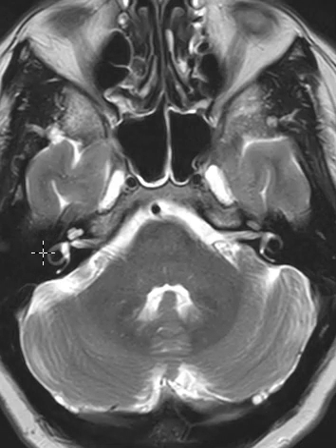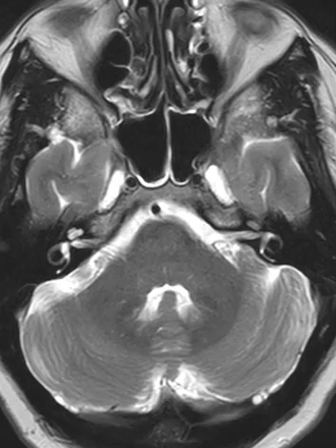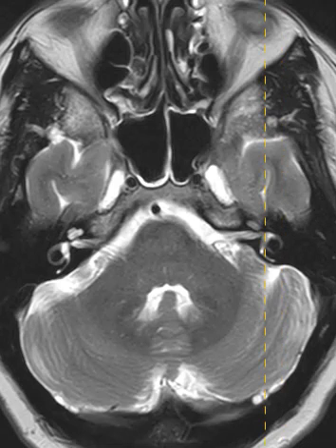Now we're going to look at the semicircular canals on what we call a sagittal view, which is a 90-degree view to this. We're going to be slicing from front to back.